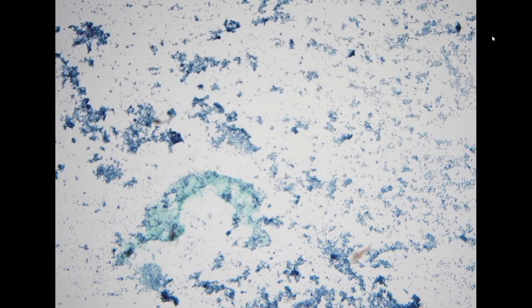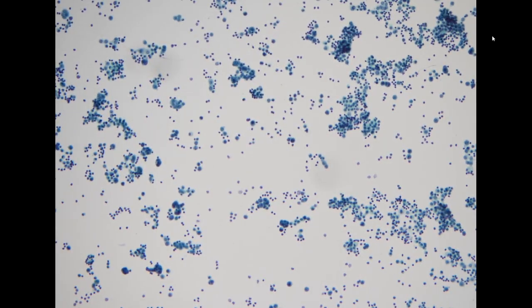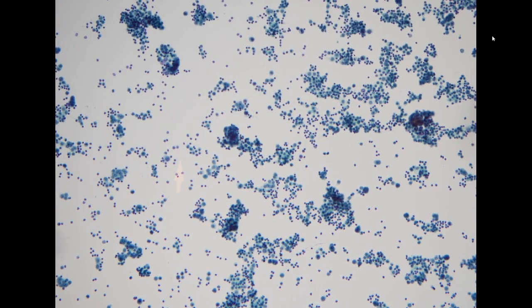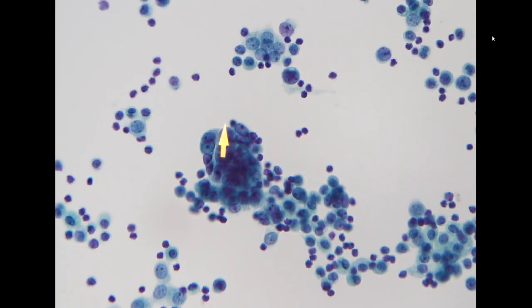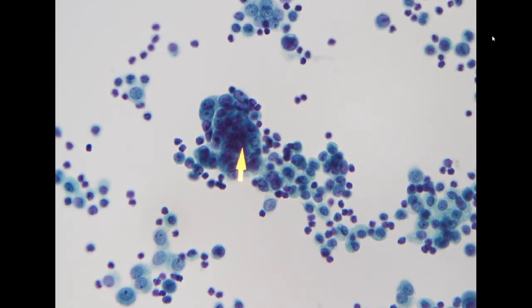I think this specimen is very difficult to interpret. A 63-year-old male, a lot of cells. He doesn't have a confirmed primary lesion. Here on low power we see a lot of inflammatory cells and histiocytes. We start to see a few clusters forming tight clusters of cells. It looks a little bit indistinguishable from the adjacent histiocyte-looking cells.